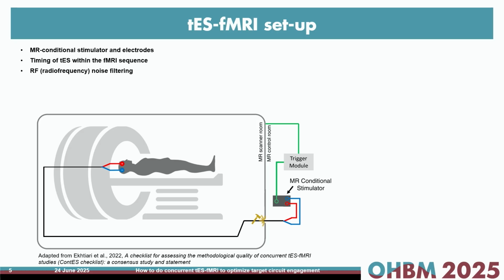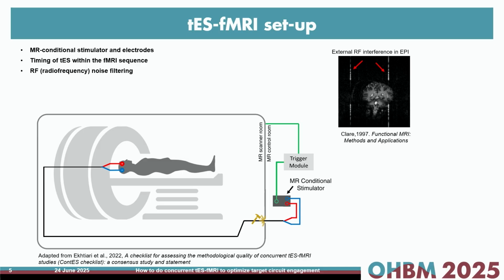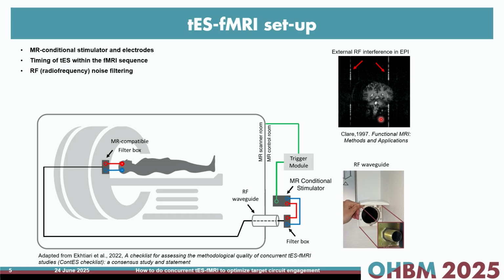And so just drilling a hole through the wall to make the cables go through would ruin this cage, and you could have artifacts like these vertical stripes that I show here. Let me get my pointer here. So one way to address this is to filter your signal.